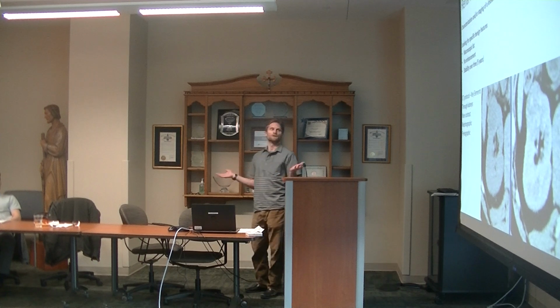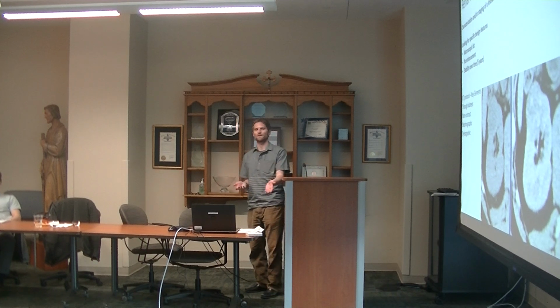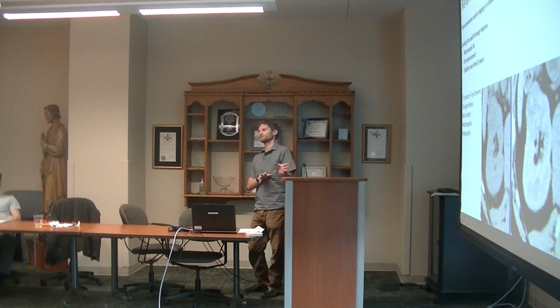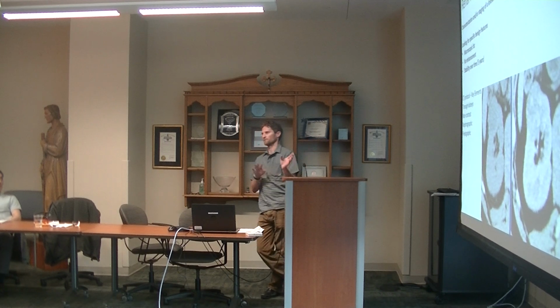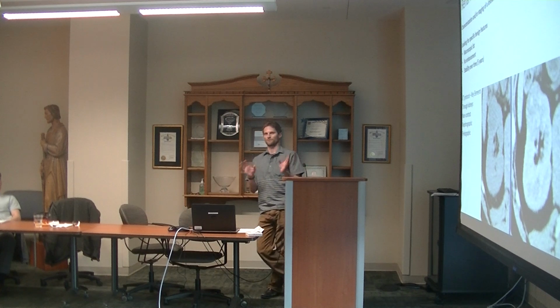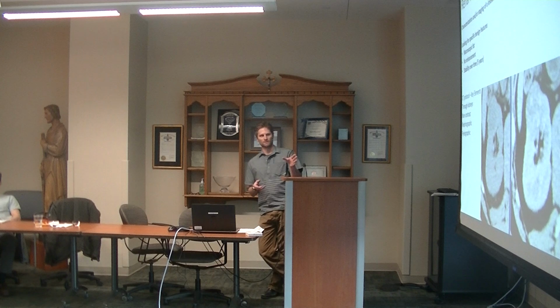Either they had a CT scan and saw a mass that they couldn't call a benign cyst or something else benign, or an ultrasound or something, so now they're doing the CT. We're trying to push these renal mass cases over to MRI. We prefer to do these with MRI, but you'll still see orders for this, and there are still good reasons to do the CT versus the MRI.